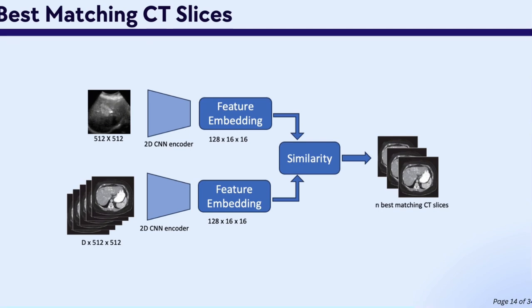After training, the encoder extracts feature spaces for each CT slice and the given ultrasound image. We compute cosine similarity to identify 50 consecutive slices which are most similar to the ultrasound image. By narrowing our focus to these slices, we dramatically reduce computational overhead without sacrificing accuracy.